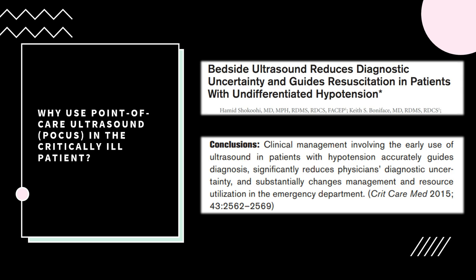Healthcare providers often ask why I use point of care ultrasound for the critically ill patient. Well, first off, there are no randomized controlled trials with a mortality benefit yet, but here's a good article. Notice the conclusions show that clinical management involving the early use of POCUS in hypotensive patients accurately guides diagnosis, significantly reduces physicians' diagnostic uncertainty, and substantially changes management and resource utilization.